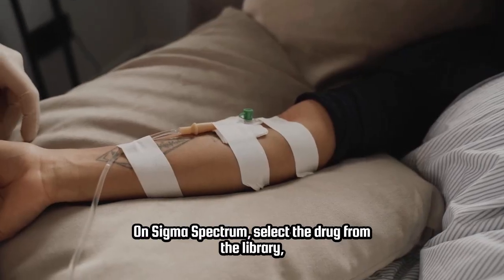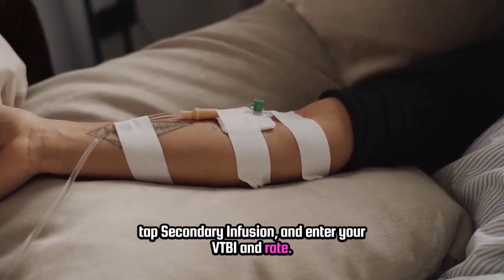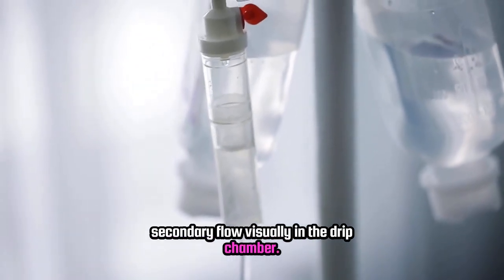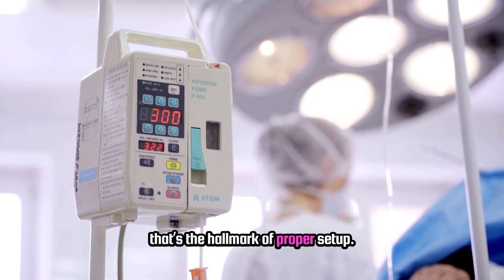On Sigma Spectrum, select the drug from the library, tap secondary infusion, and enter your VTBI and rate. Make sure the secondary is higher and the clamp is open. Then hit run and verify secondary flow visually in the drip chamber. Once complete, the primary automatically resumes — that's the hallmark of proper setup.